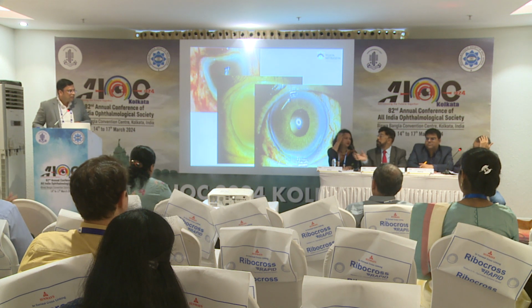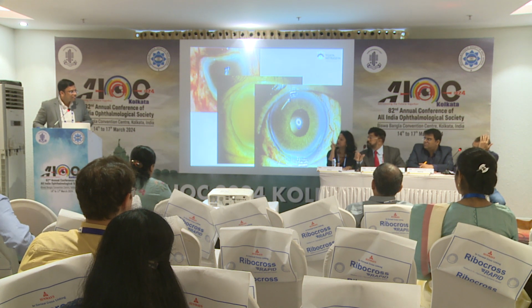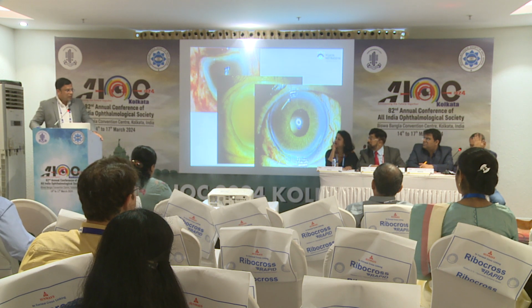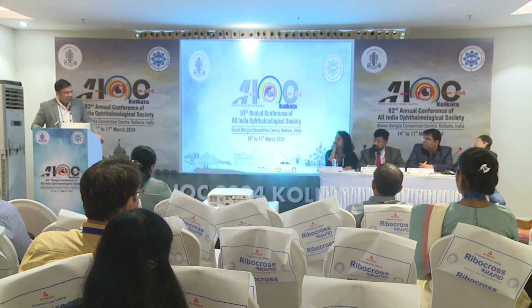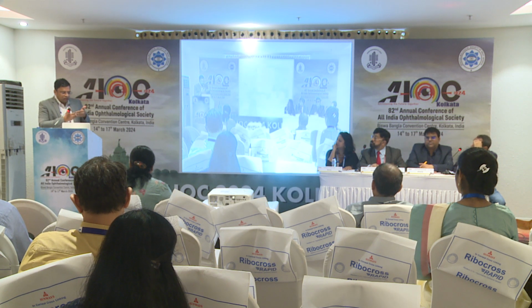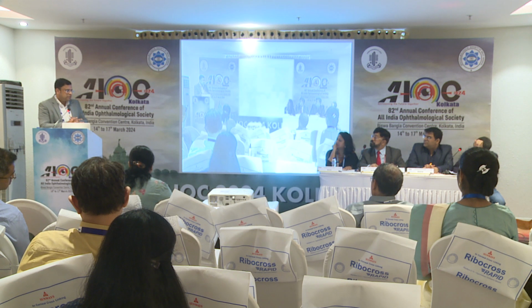Okay, sir. She meant that since there is no iris, the post-op intraocular pressure should go up. It was normal, sir, because of the worry that the full size of the company iris would cause rubbing at the angle. So we had reduced it by 1 millimeter and refined it so that there was a gap between the actual angle and the artificial iris.